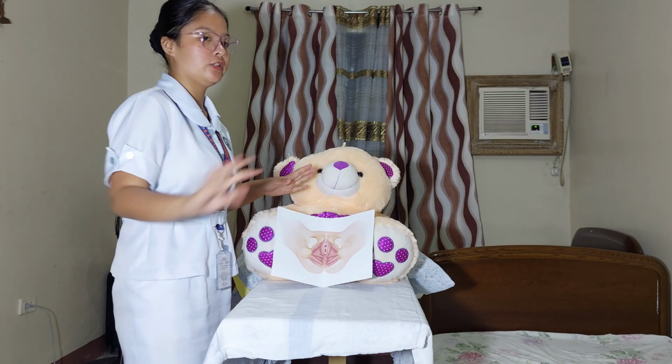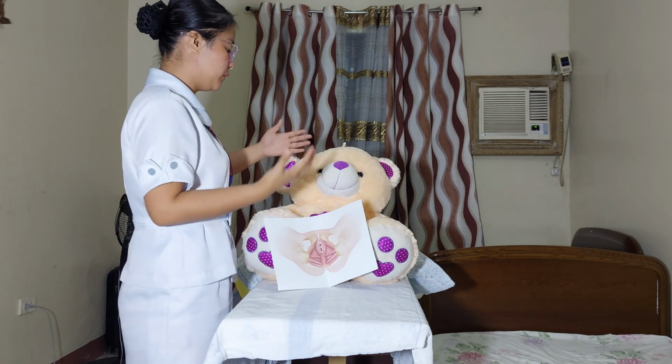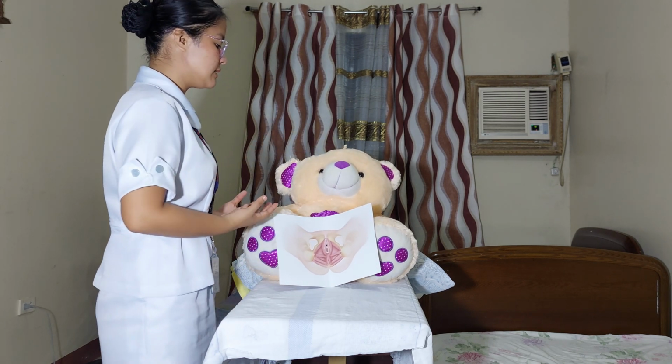So now, position ko muna yung patient ko. So, ma'am, can you lay down comfortably po? You can lay down comfortably po and flex your two knees.